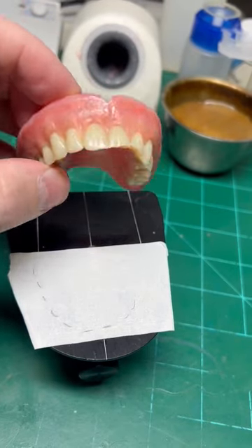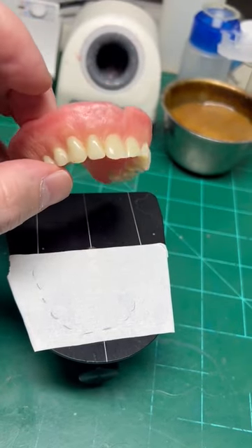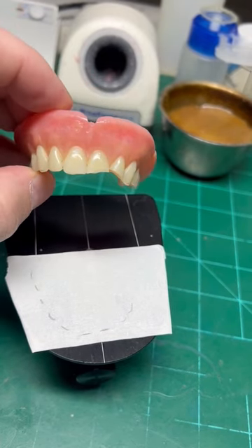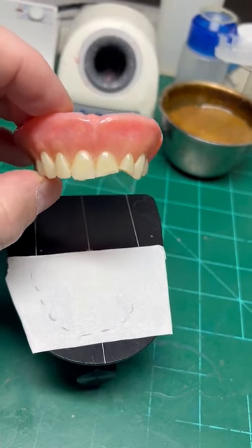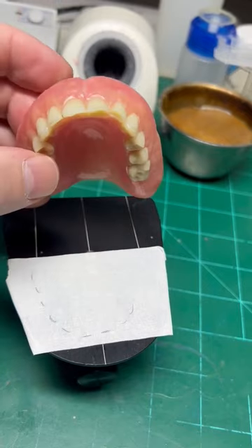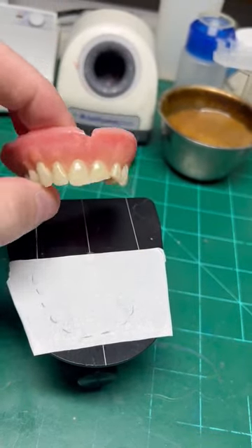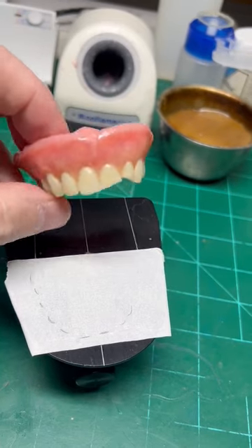Now this denture has acrylic and also composite facing that has slight hairline fractures to it. So first things first, because we were not provided an opposing in a bite, I need to capture at least the arc and the position at the height of these teeth.